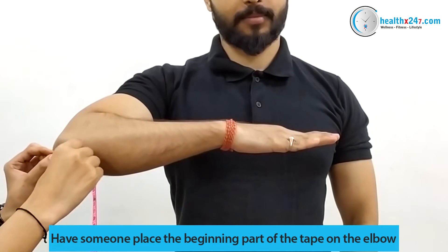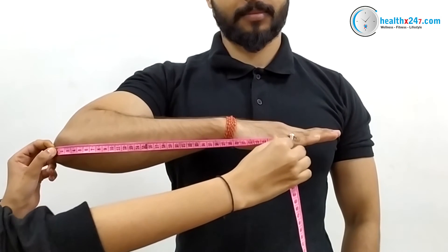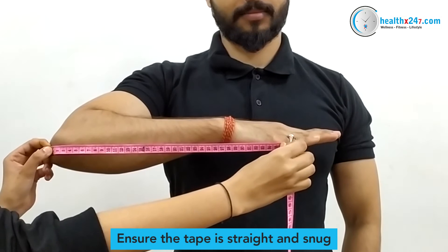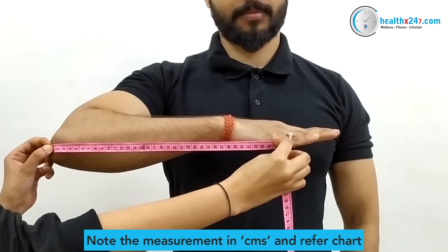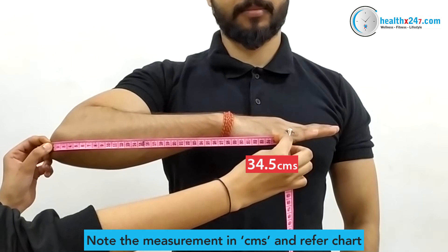Stretch the measuring tape to the metacarpal — this is the width measurement. Ensure the tape is straight. Note the measurement in centimeters and refer to the sizing chart to know the best size for you.